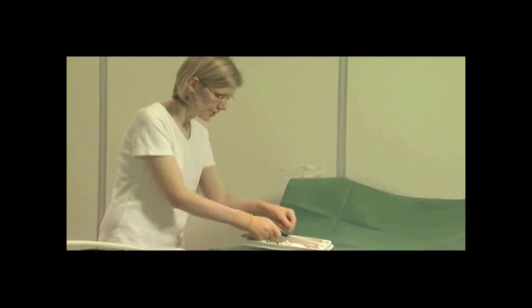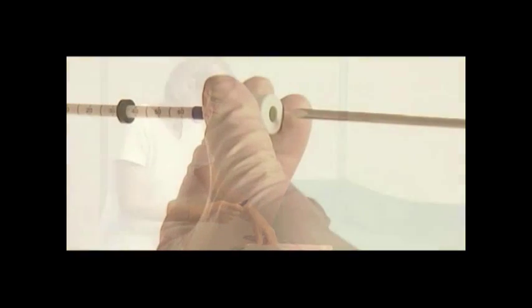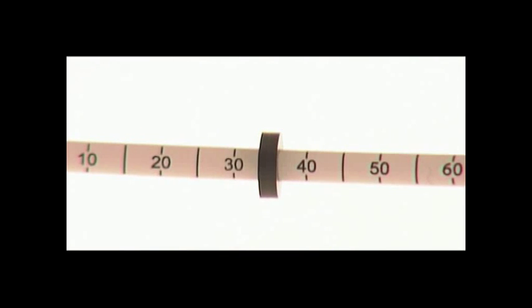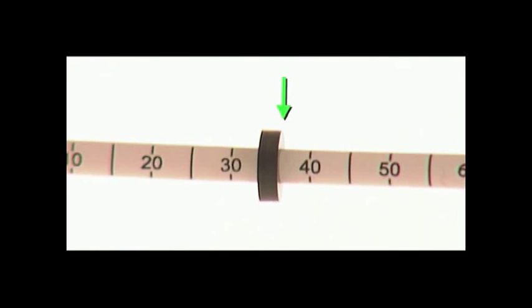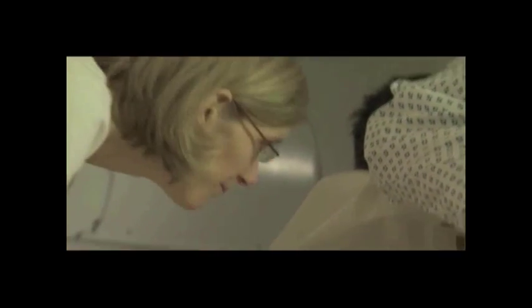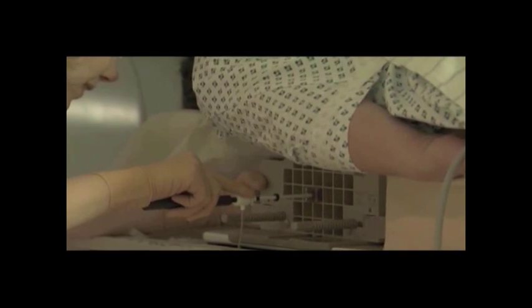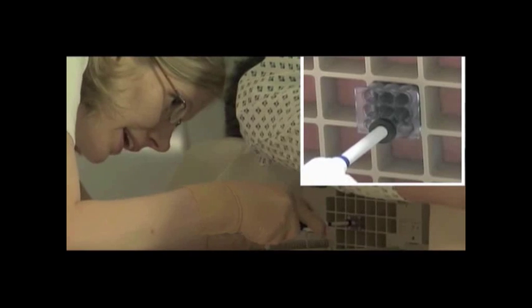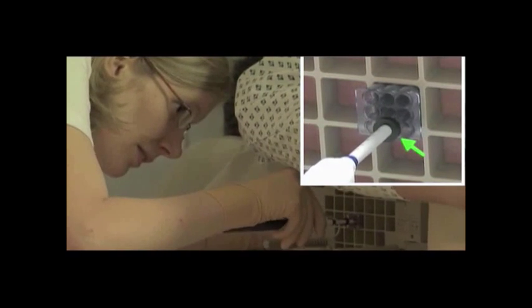Insert the nine-hole needle guide in the appropriate grid space based on the targeted calculation. Remove the remaining contents of the introducer localization set. Place the introducer stylet into the introducer sheath. Adjust the depth stop on the introducer sheath to the calculated depth of target, reading the depth from the side distal to the patient. Place the introducer sheath and stylet into the selected location of the needle guide. Holding the sheath in place, use a continuous clockwise rotating motion to advance the stylet into the breast. This motion will help minimize tenting of the skin. Continue advancing until the depth stop is flush with the needle guide in the grid.